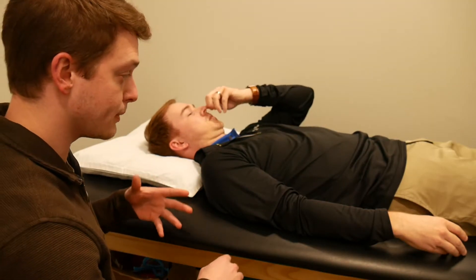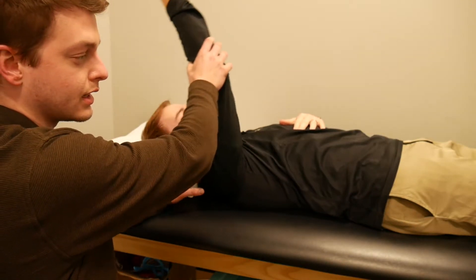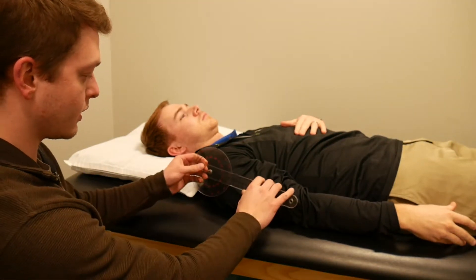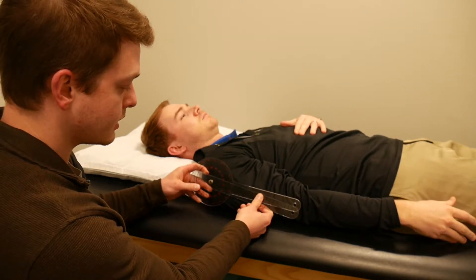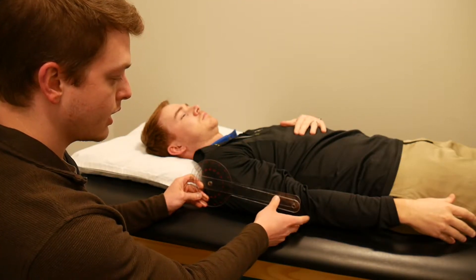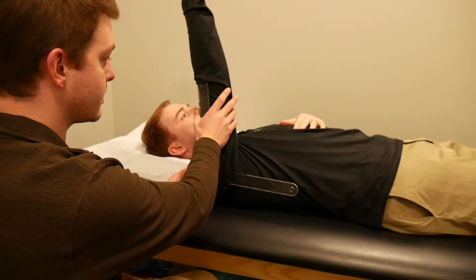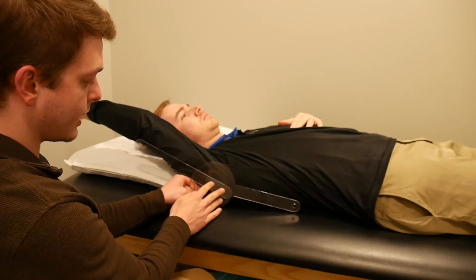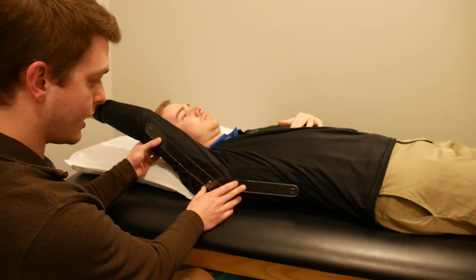Just like with any other range of motion measurement, you can have them actively or passively range first just to get an idea of where they're going to be and get a functional movement, and then you can place your goniometer. Axis again will go right on the acromion or AC joint area, keep the stationary arm in line with the trunk, and as they come up into shoulder flexion allow the goniometer to follow the mid shaft of the humerus. Make sure the axis does not migrate off the AC joint as they move up into shoulder flexion, and there's your measurement.